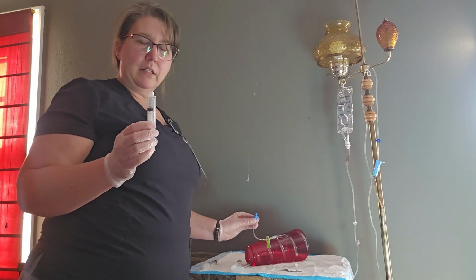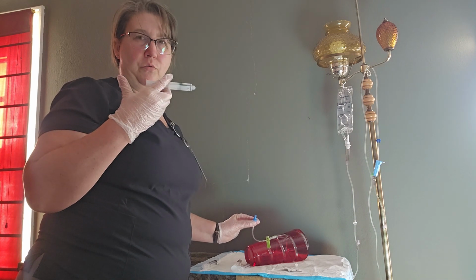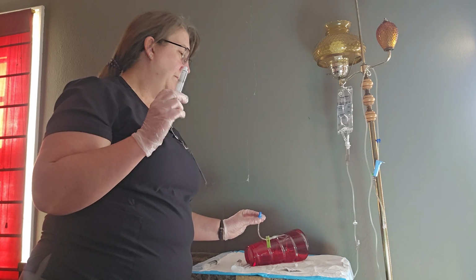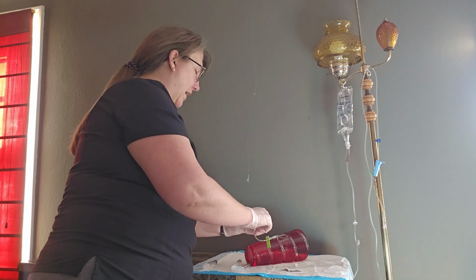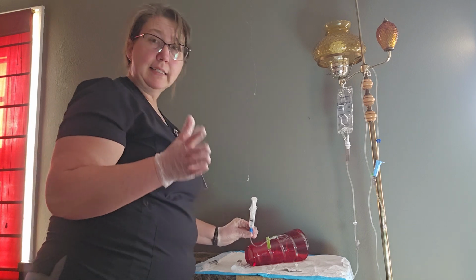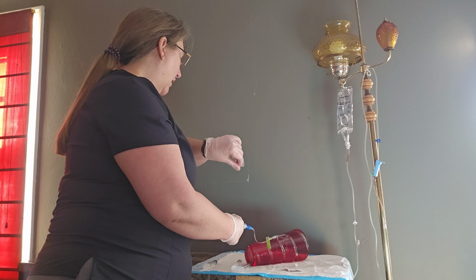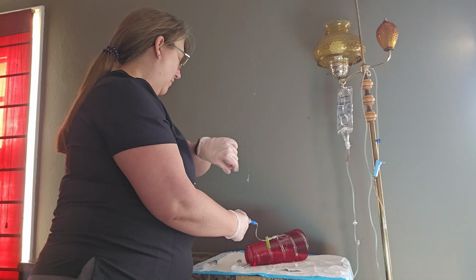Now, like I said previously, how long you take to insert the medication into your J-loop depends on the medication. So that's different for every medication. It has dried, so I will attach now. Say it takes 1 minute as an example. So I'm going to stand here and push the medication into the IV and time it with the second hand on my watch for 1 minute.